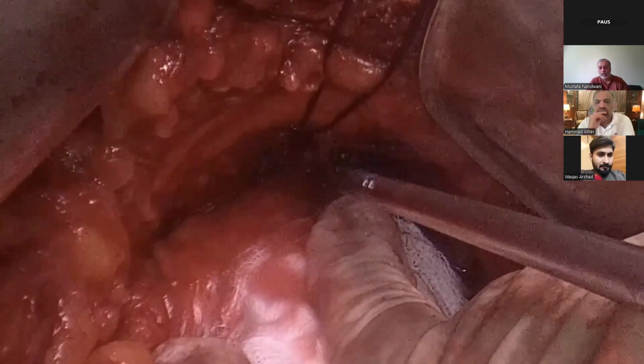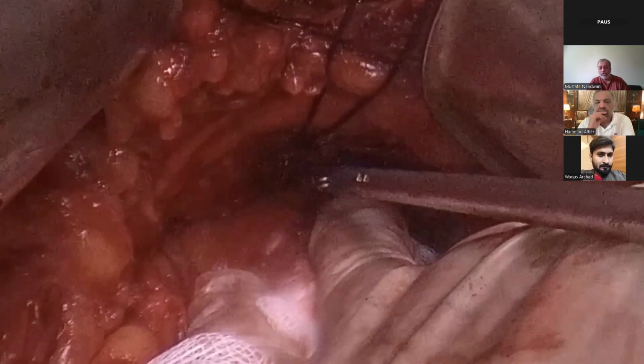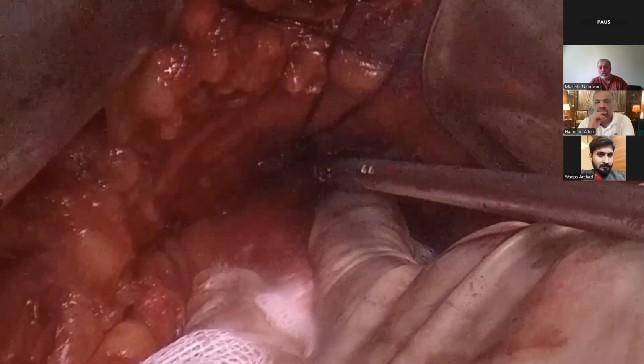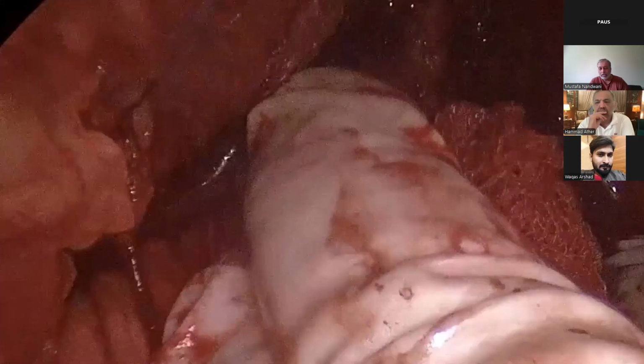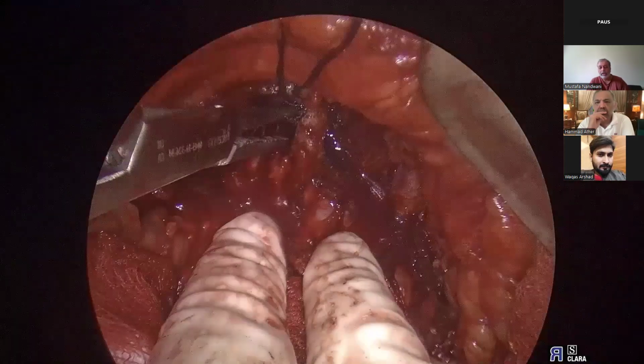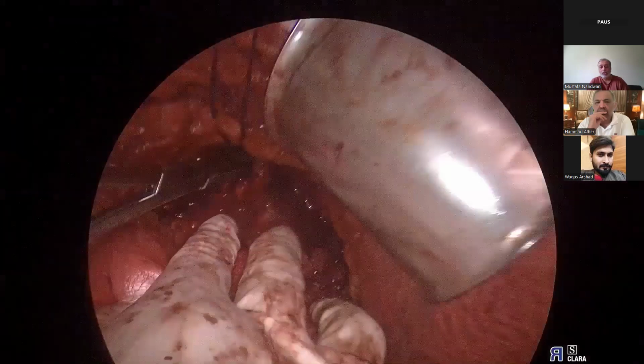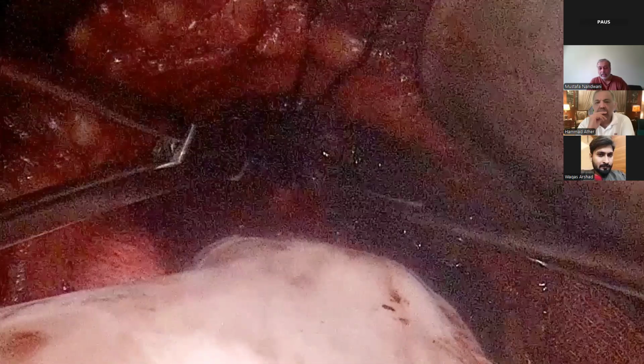Now I use the LigaSure, and the trick is to press the bladder down and cut it horizontally. So you need to lift the DVC up. Once you have lifted the DVC, you can see there is a right angle under the urethra, and I'll make a nick there. Once you have made a nick there, you'll see there's a catheter there.